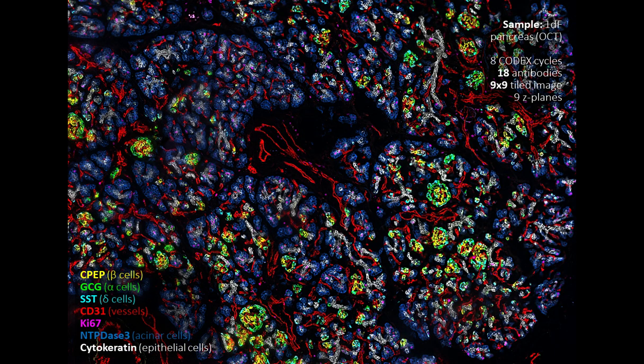And then here is just zooming in a little bit more so you can start to get a sense of the resolution from these images. And again, we've used a mixture of both the pre-validated, pre-conjugated Akoya antibodies with our antibodies, and that's really enabled us to highlight multiple different compartments of this tissue.